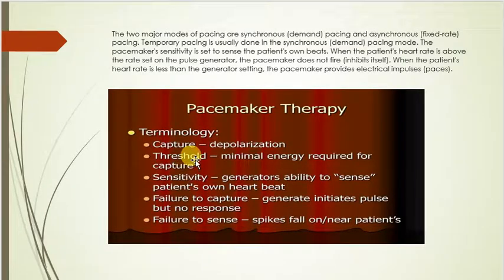So you'll hear there's two major modes of pacing. You have synchronous, which is on demand, and you have asynchronous. So on your pacemaker, which y'all probably won't see an external pacemaker until you go to the ICU, they're going to be either on demand. That means that the pacemaker is sensitive enough to see the underlying rhythm of the patient, and so it's just going to pace when it needs it. So it's going to let those intrinsic beats come through.